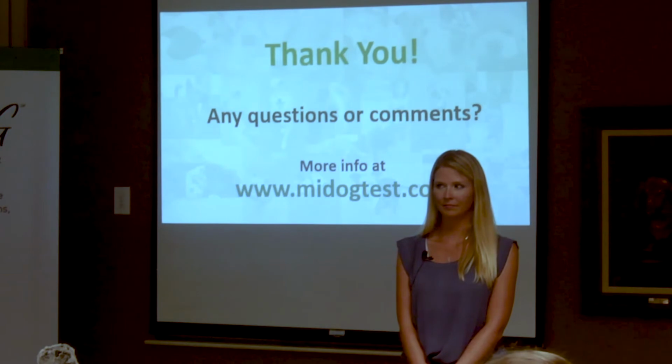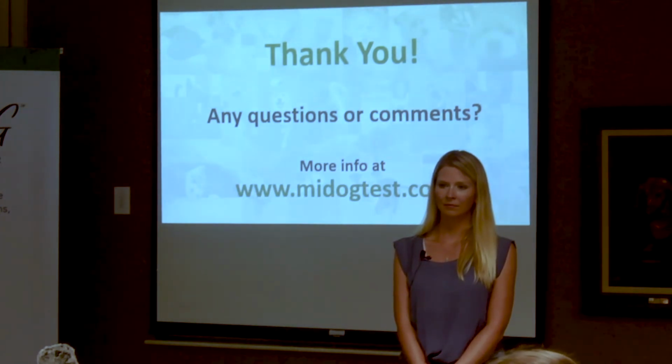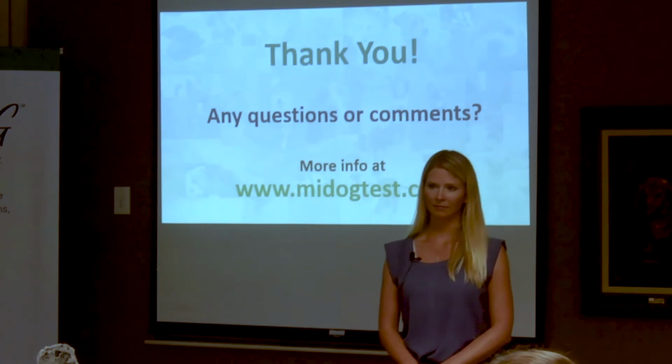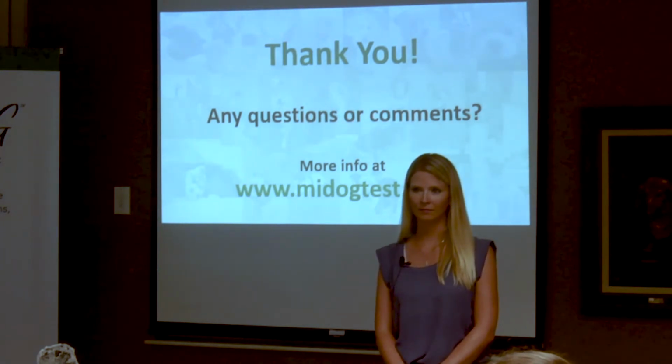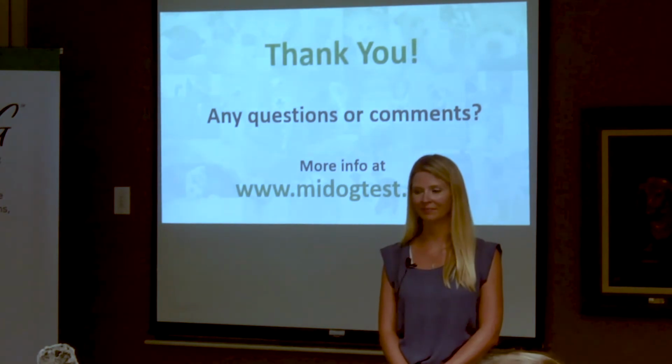I'm happy to talk about any of this stuff. We also did something nobody mentioned because we're still in the testing phase of it: we swabbed colons on dogs, looking for normal flora. And I'm gonna tell you what, you should have seen the variety of that, especially with the diet. It was extreme. Our clinic uses IDEXX and we do the fecal PCRs, and upper respiratory, and that only comes back with like 12, and it says yes or no.